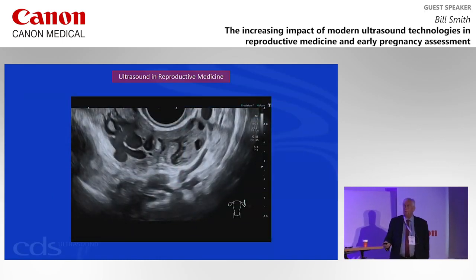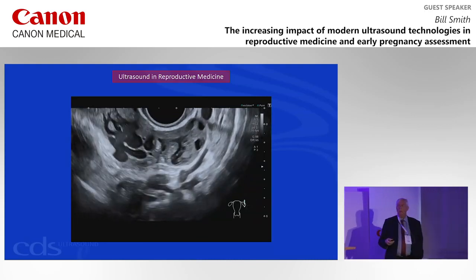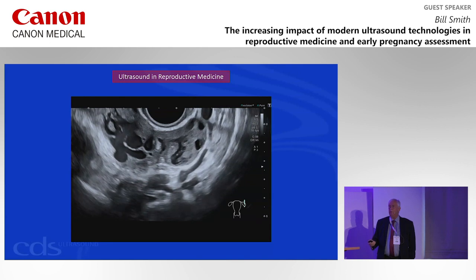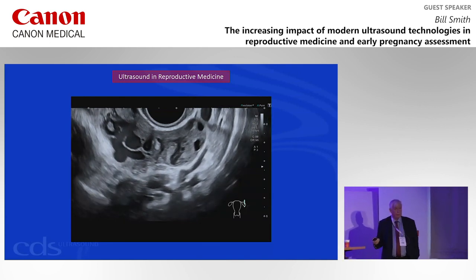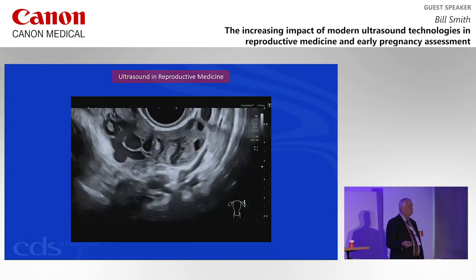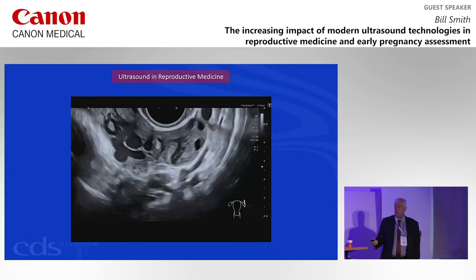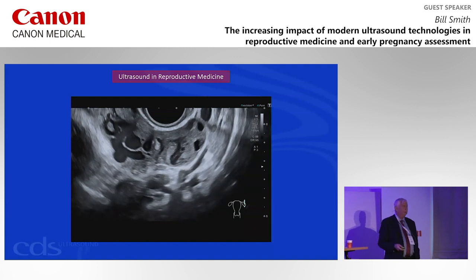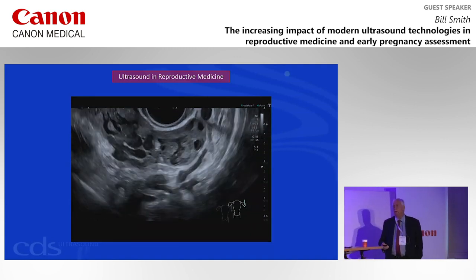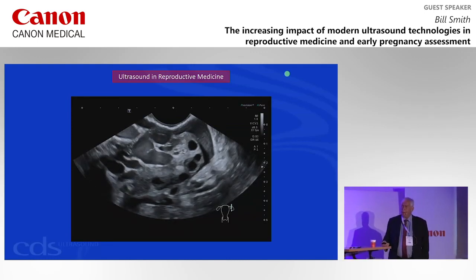And also, we're not just interested in pre-ovulatory ovarian changes. We're very interested in what happens after ovulation, as you'll see later on in the talk. So we need good contrast to show us hemorrhagic luteal cysts. We do show them better once we put on the SMI, as you'll see later on, but this is the kind of Grayscale that we expect from our advanced ultrasound systems.